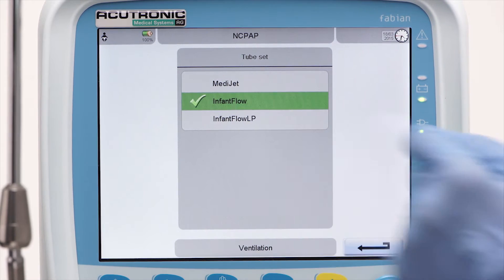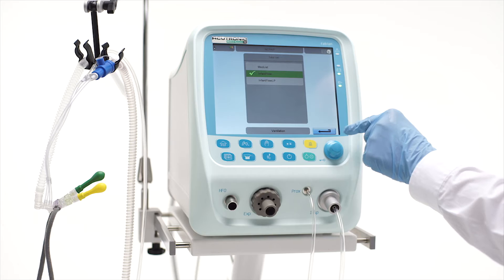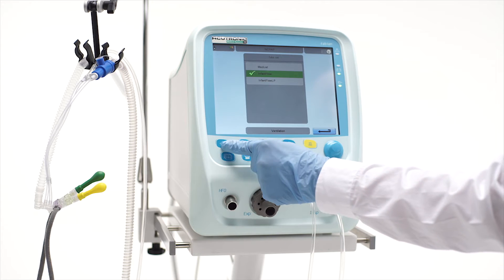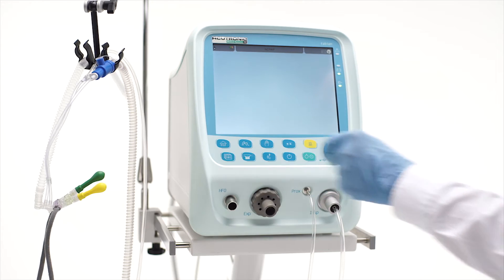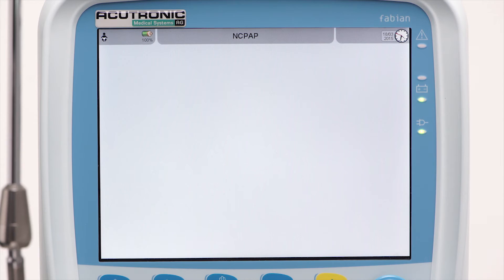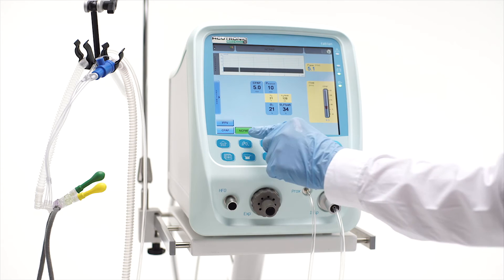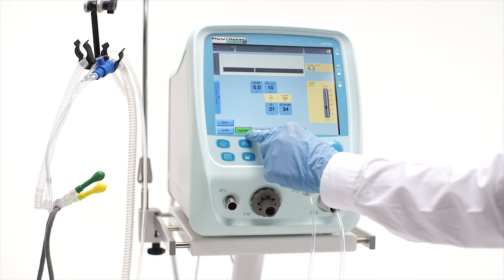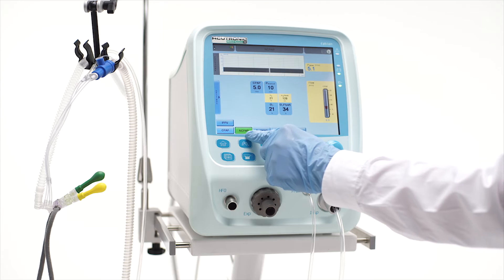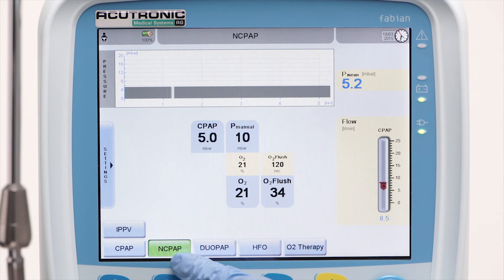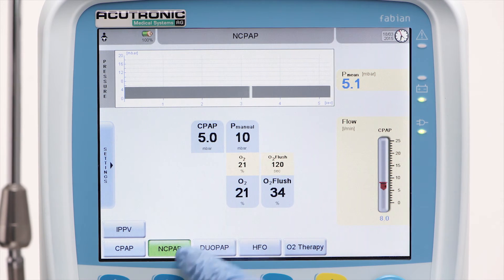Let's use InfantFlow as an example. Press the home button to exit the page and to return to the main screen. In NCPAP, the following parameters need to be set: the CPAP level.